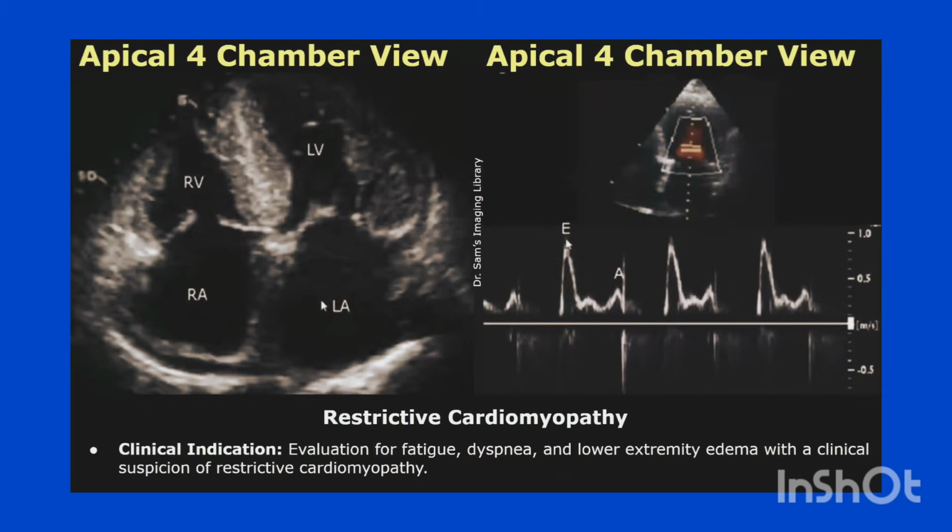Now we move on to restrictive cardiomyopathy. Clinical indication is evaluation for fatigue, dyspnea, and lower extremity edema with a clinical suspicion of restrictive cardiomyopathy.